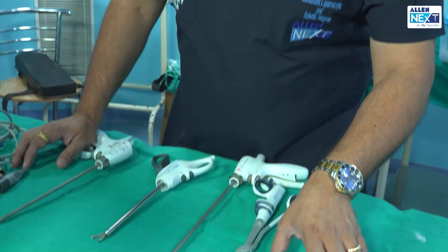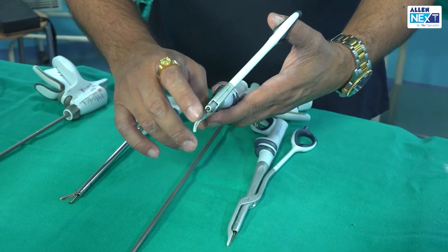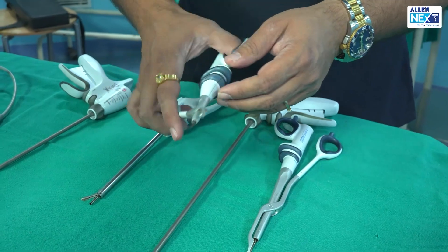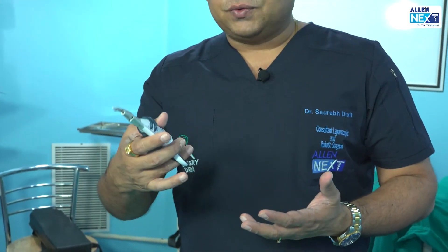This is one harmonic. How do you identify it? This is a lower metallic jaw and this is the upper non-functional dampener Teflon sheath. This is a harmonic that I particularly use for head and neck surgeries.